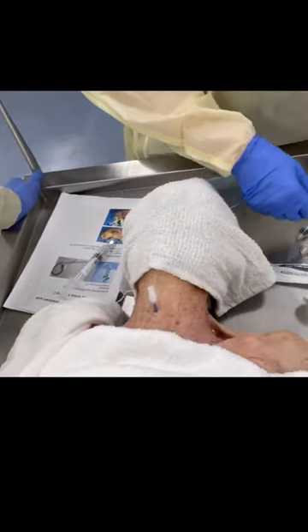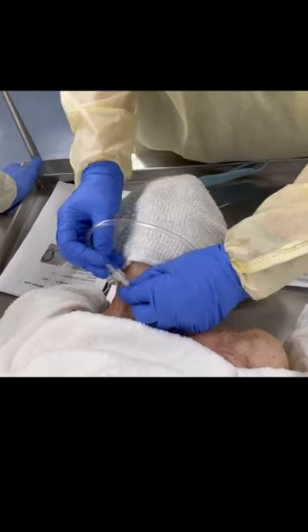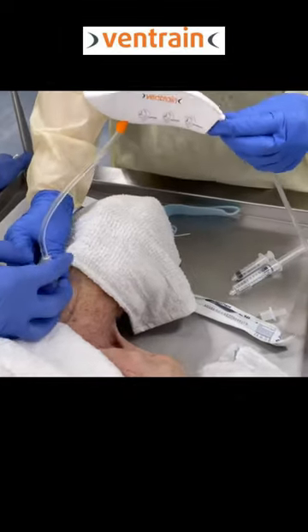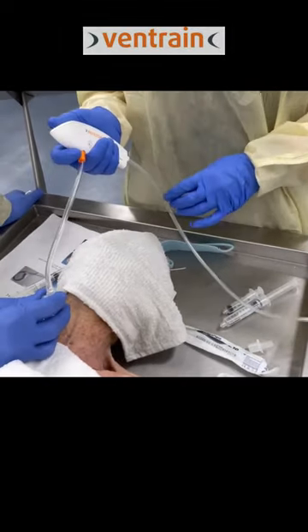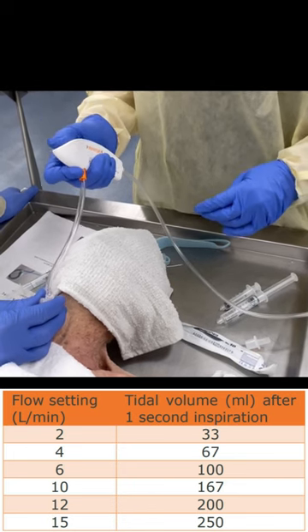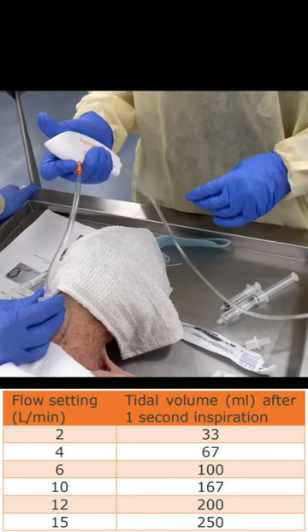Now let's watch this. So we will hook this up. Okay, if you'll stabilize that — two seconds. I'm sucking the air out. Two seconds in 500 ml. That's at 15 liters per minute.